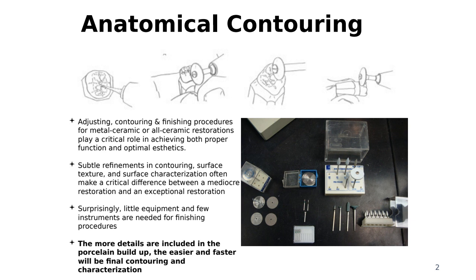Yeah. So the manufacturers now make kits, and they give you the whole array of stones or diamond burrs that you might use for that procedure, going from coarse to fine, right? So just because a kit has burrs or stones going from a coarse texture to fine doesn't mean you have to use them.